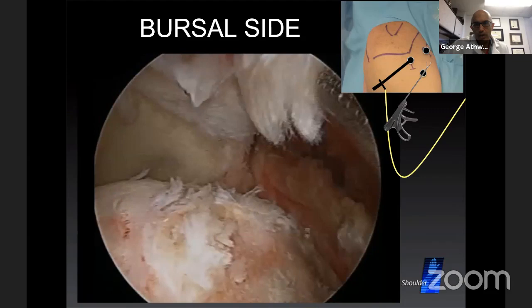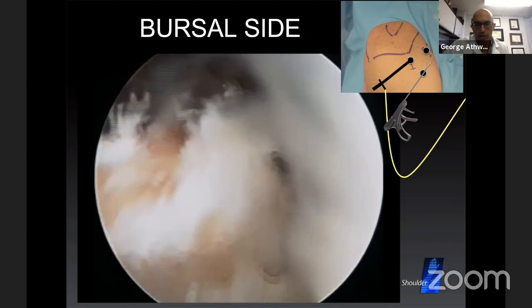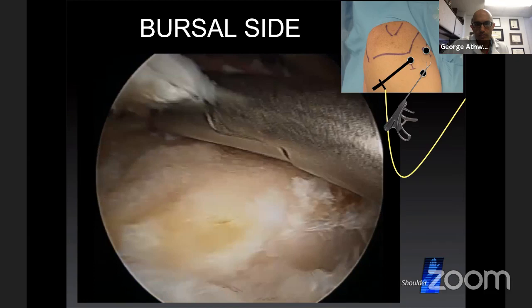And now this is the lesser tuberosity. And this is the biceps groove, the superior portion and the inferior part of the biceps groove. Back there is going to be the conjoint tendon, right there. And this is the subscapularis. So I'm going to reattach that to the lesser tuberosity. And so this is a complete subscap tear once again.